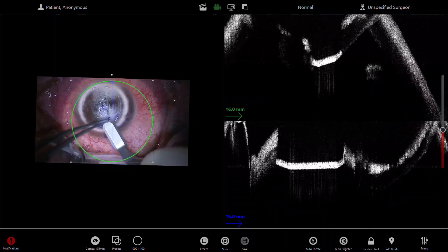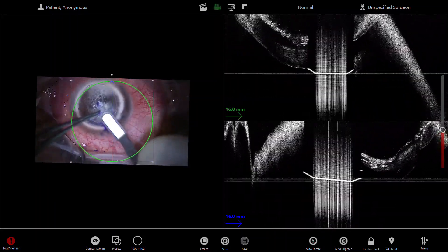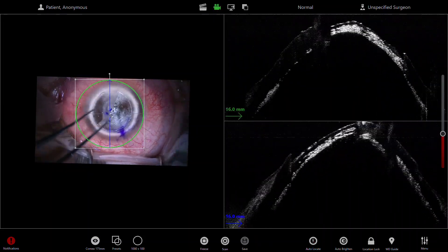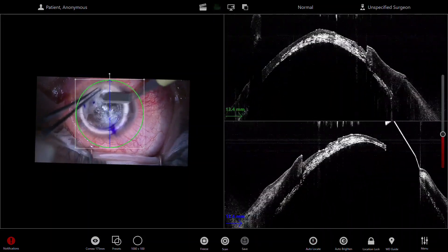Now, as usual, I use a crescent knife just to take off the anterior lamella cap. The OCT is just a guide here to see what's happening — it's a good teaching tool for people watching in theatre, but it also helps judge the depth and how much stroma you have left.